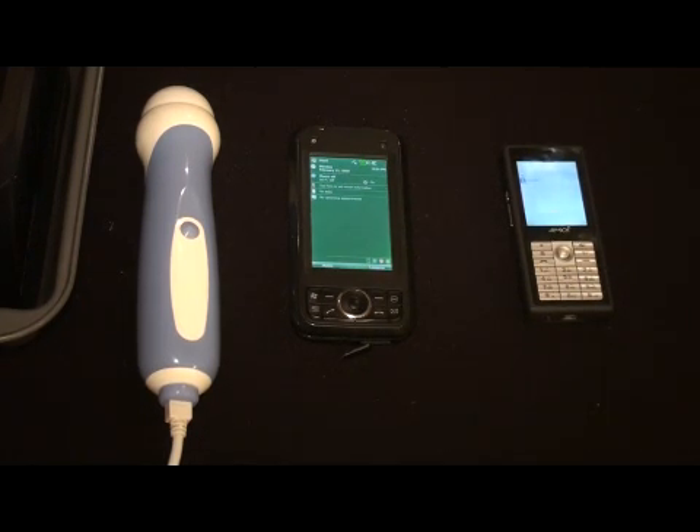Hello, I'm here to demonstrate the world's first ultrasonic scanner implemented in a standard Windows Mobile cell phone.